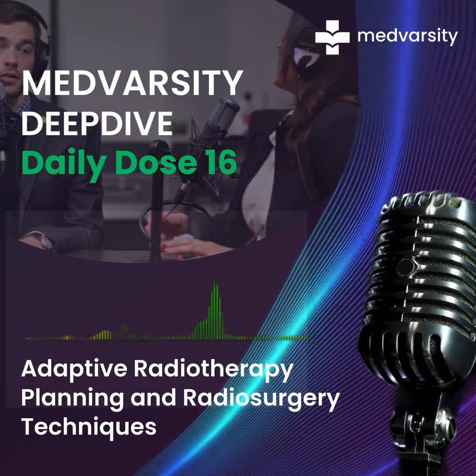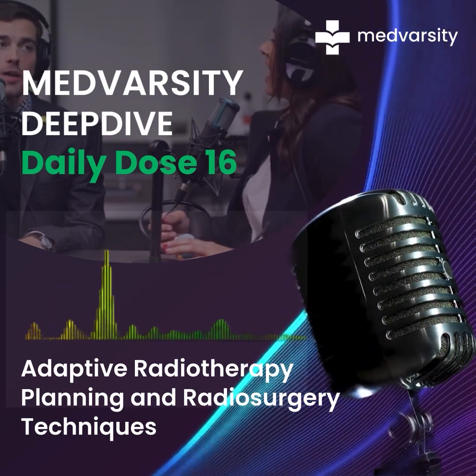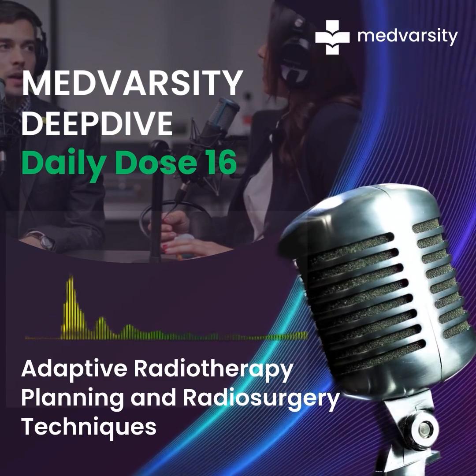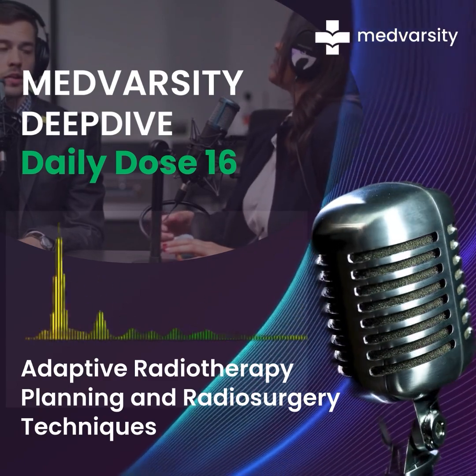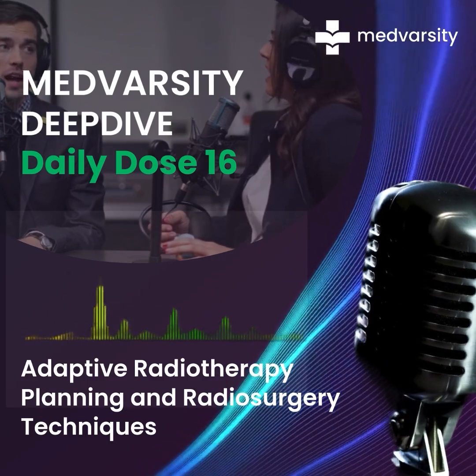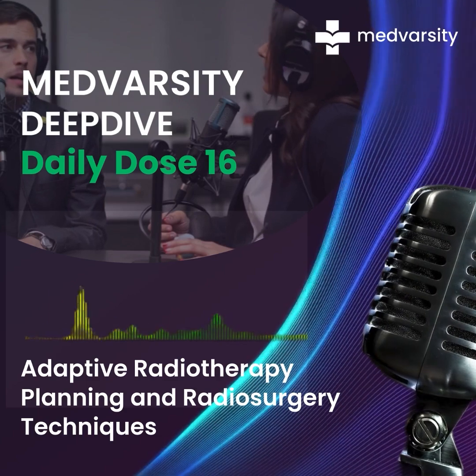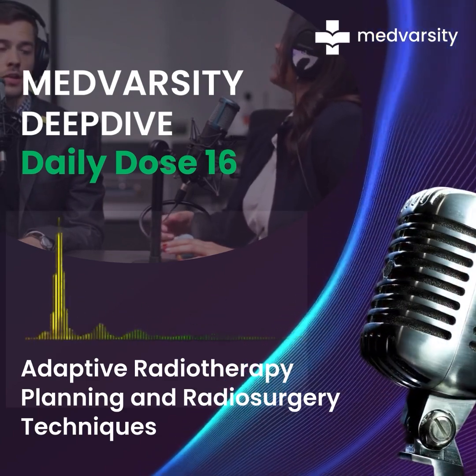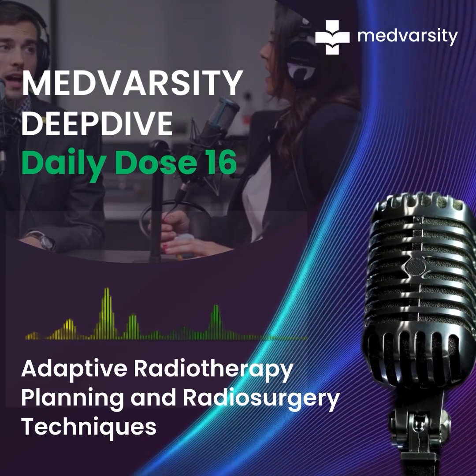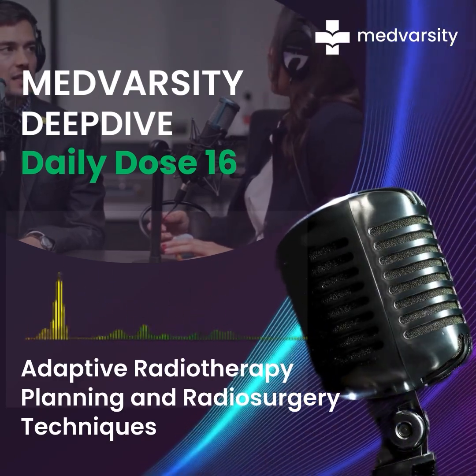There are a couple of key types. Offline adaptation is like making periodic course corrections. We're checking in every so often and making adjustments based on new imaging scans. So it's not real time, but it's a step in the right direction. And then you have online or real-time adaptation, which is like having a GPS for your radiotherapy. You're allowing continuous dynamic changes to the plan based on real-time feedback. So it's like those radiation beams are constantly adjusting to hit the target no matter how much it moves. That's a great way to think about it.